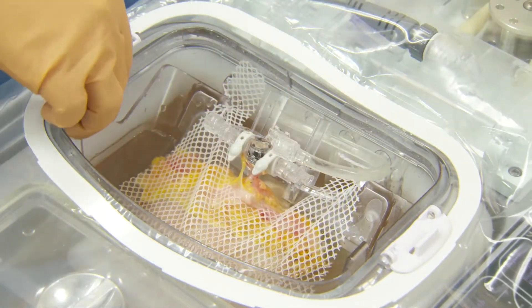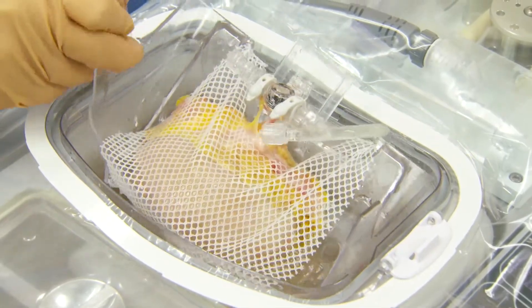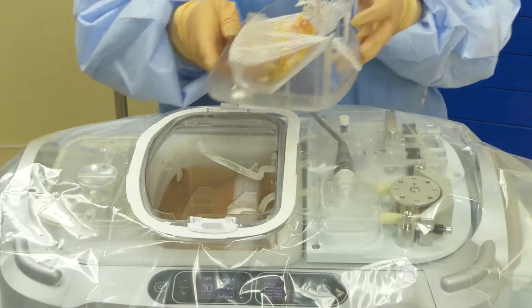Remove the kidney cradle. This can then be taken to a back table.